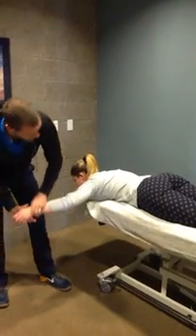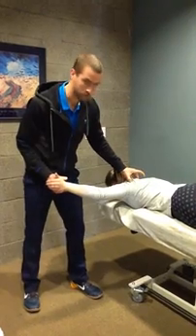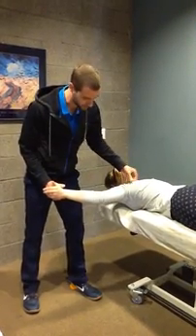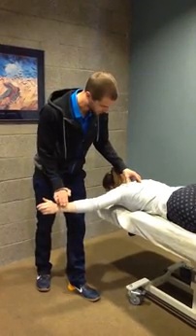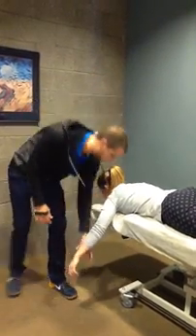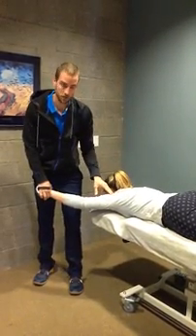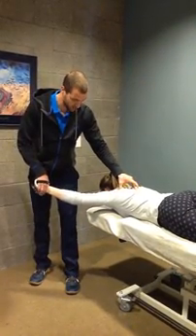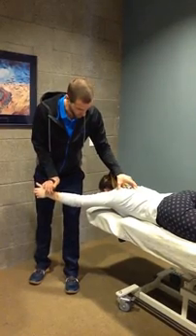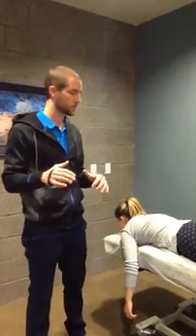So for the mid-trap, we're going to be at a 90 degree angle, thumbs up. We're trying to hint at, bring that shoulder blade towards the spine, arm level to the trunk. Hold your arm here. Don't let me move you. Hold, hold, hold, and relax. Pretty weak there. Then we're going to go into low trap, so roughly 120 degrees. Again, thumb up, shoulder blade towards spine. Hold your arm here. Don't let me move you. Hold, hold, hold, and relax. And again, we're going to do 2 trials of those and just take a quick rough estimate for documentation's sake.